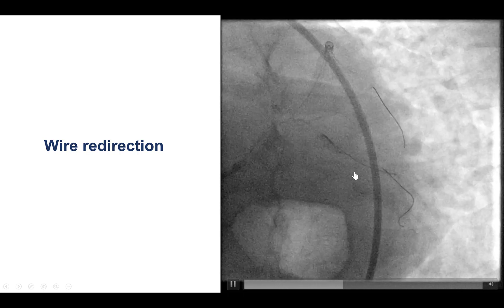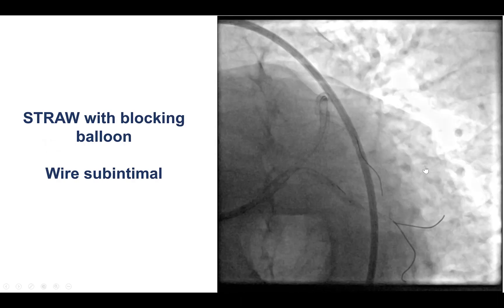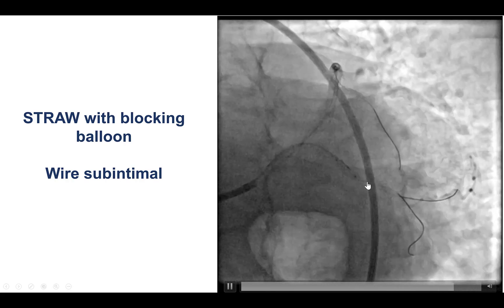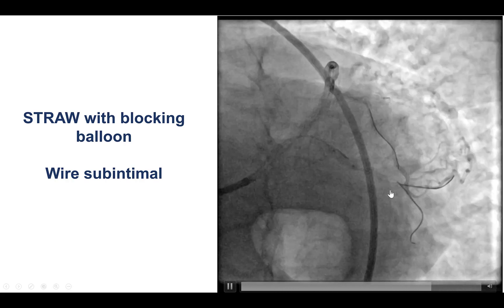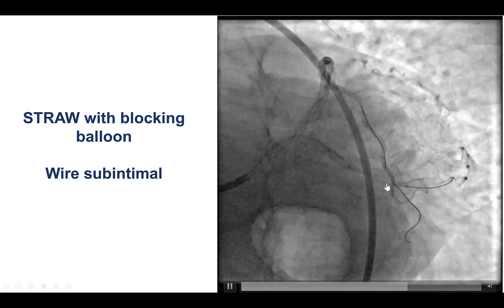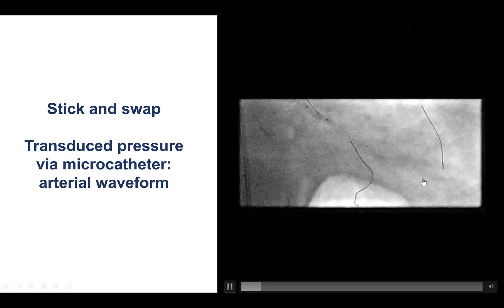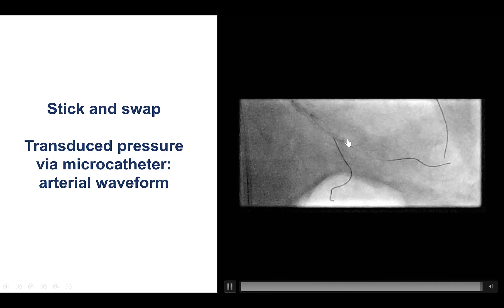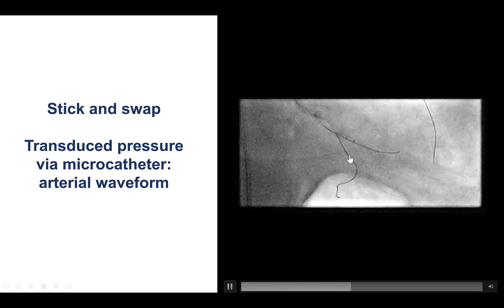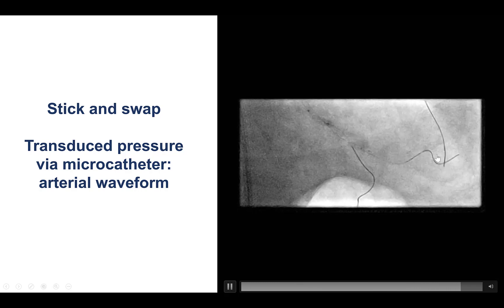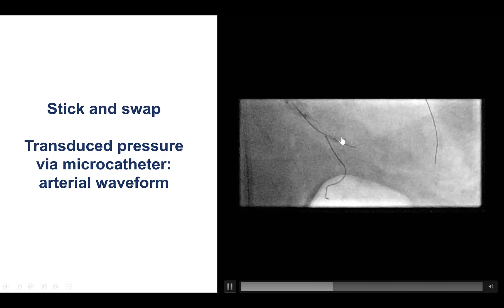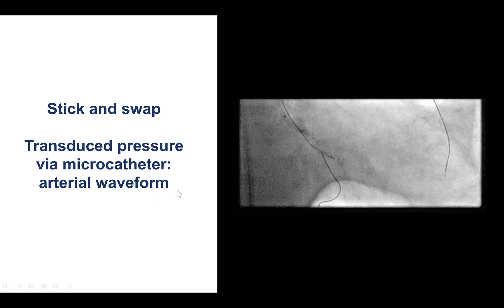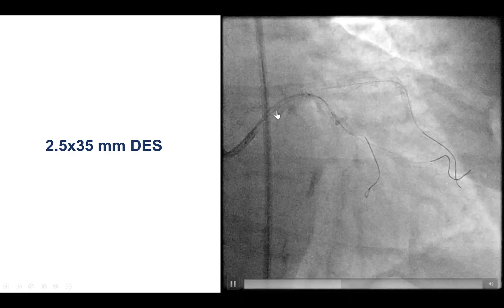Using the side-base technique, we were finally able to advance a Sion Black guidewire along the course of the obtuse marginal. At this point, there was significant hematoma, so we used a balloon to block anterograde flow of blood and then aspirated through a microcatheter. There was some expansion of the vessel, and we can see that the guidewire is in the sub-intimal position. We then did again attempts for re-entry using the Stingray balloon — a new one, as the old one could not be delivered. After using an Astato 20 and Pilot 200, the wire seemed to enter across the course of the vessel. We had difficulty with visualization, so we used the technique of advancing a microcatheter and transducing the pressure, which showed an arterial waveform, suggestive of true lumen position distally.